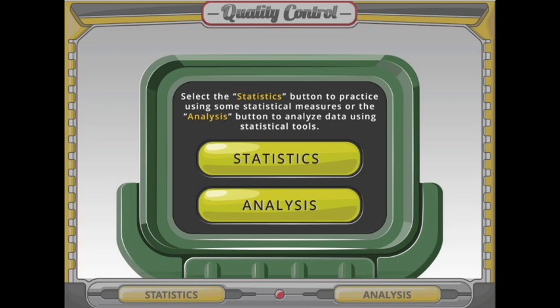Quality control is a process that scientists use to find and reduce analytical errors and improve the reliability of laboratory testing. This simulation has two parts. In Part 1, you'll learn about various statistical tools, while in Part 2, you'll analyze data from a laboratory test. To begin, select the Statistics button.